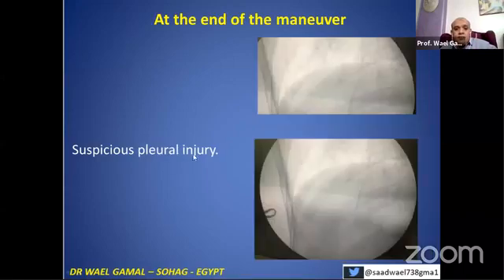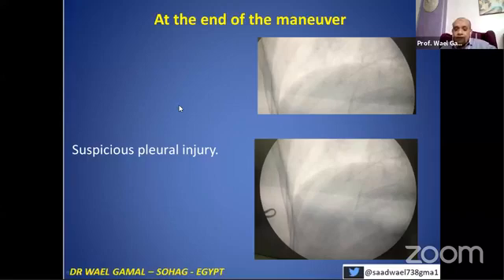If there is a suspicious pleural injury, you can intraoperatively — under fluoroscopy — ensure that the costophrenic angle is free.